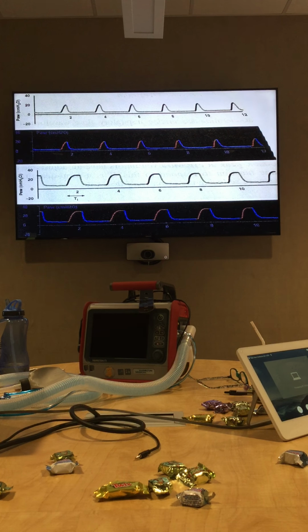So the Hamiltons are adaptive. So if I set it at 15/5, from a pressure standpoint, I actually have 20 centimeters of water pressure. So this is additive basically.